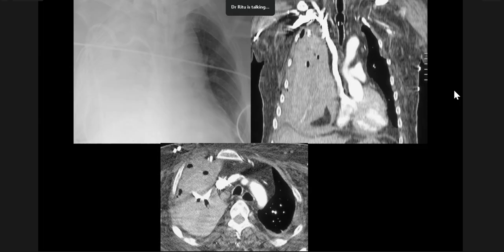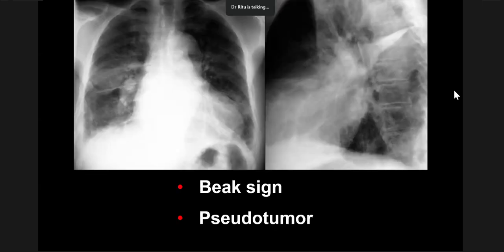So the first instinct, if you were putting in the line, is always to yank the line. And I tell people that you have to curb the urge to pull the line out, because your instinct is to think that this is in an abnormal place and you want to take it out. But what very often happens is that it is actually plugging the hole that is causing the bleeding. And so if you pull the line out, then the patient may have even more severe bleeding. So you do want to consult IR and maybe put in a stent or coils over the area with the bleeding.